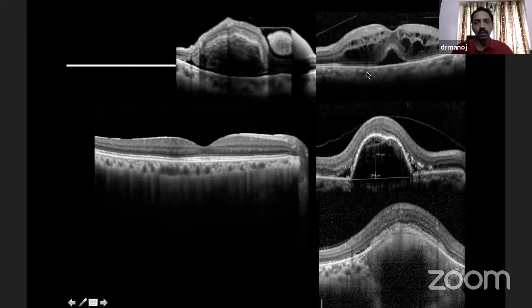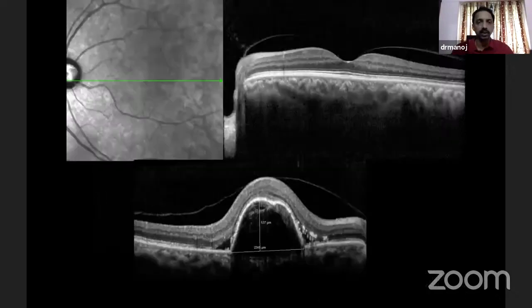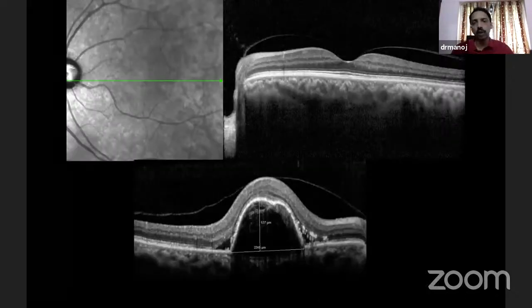It may be just the presence of fluid, or it may be some lesion of the retinal pigment epithelium altering the contour, or it could even be a choroidal lesion which is altering the contour. All this can be appreciated at one glance. Then you start going layer by layer.